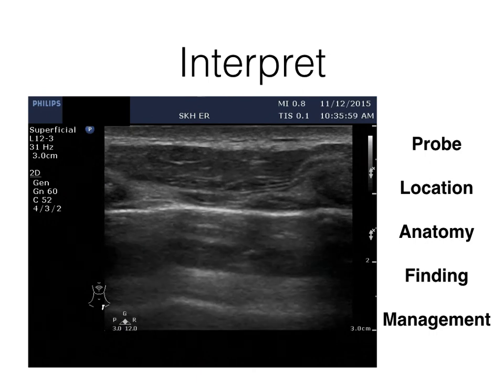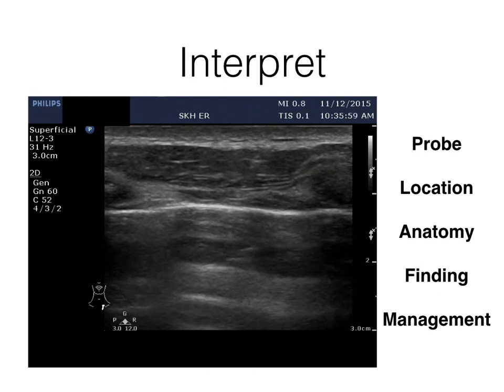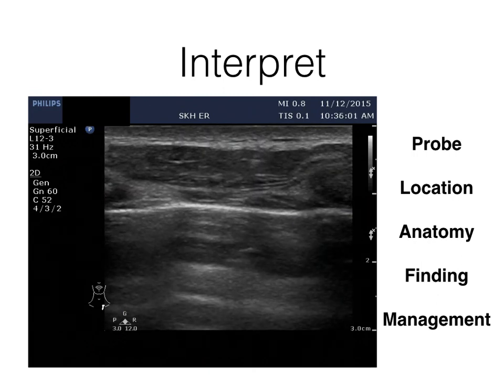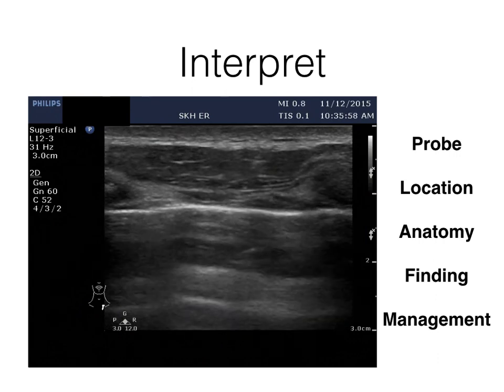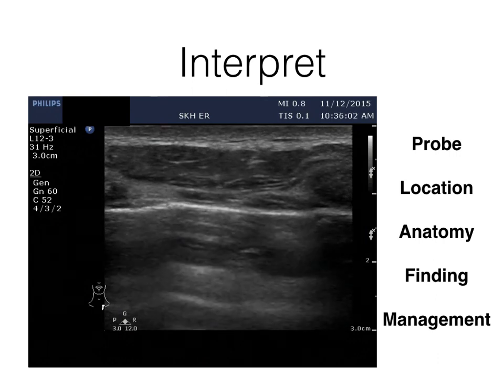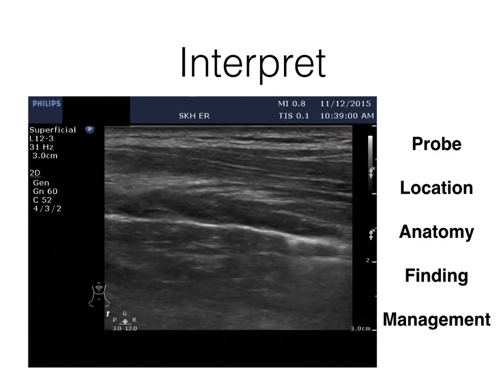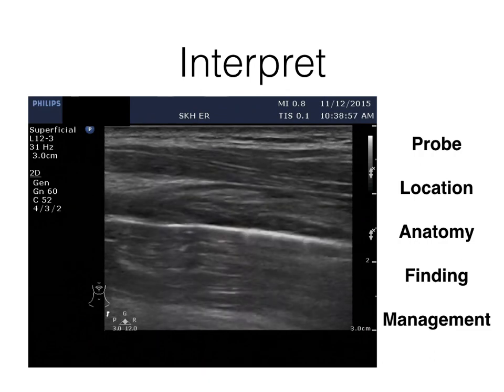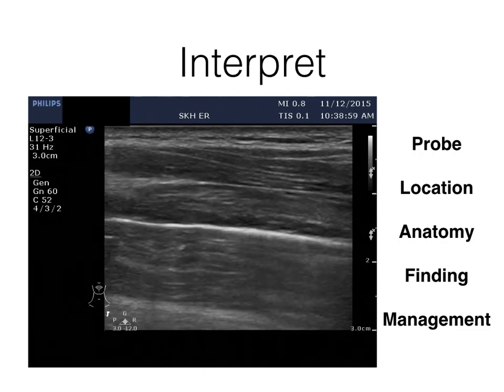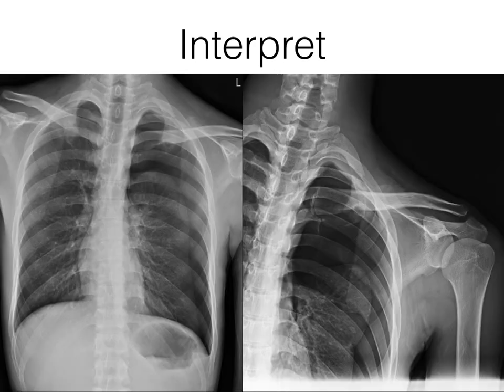Breathing. The chest wall muscle contracts instead of lung pulse. Because sometimes if you interpret it as lung pulse, you will think that the patient doesn't have pneumothorax, right? That's the tricky part. Can you find the lung point? Yes, right? So it is the highly specific sign to diagnose pneumothorax.